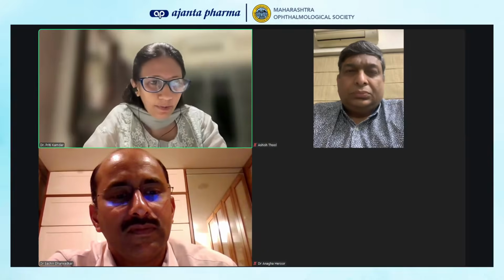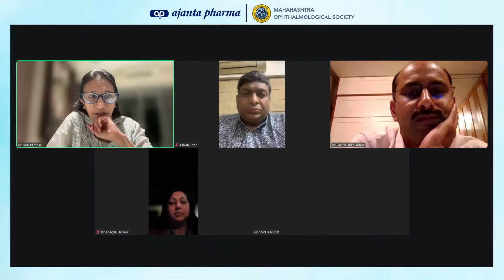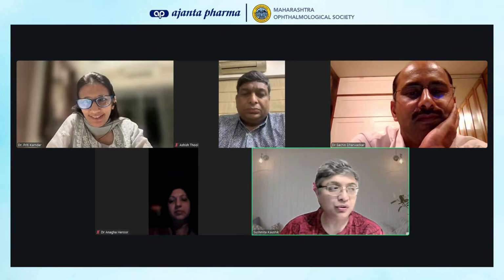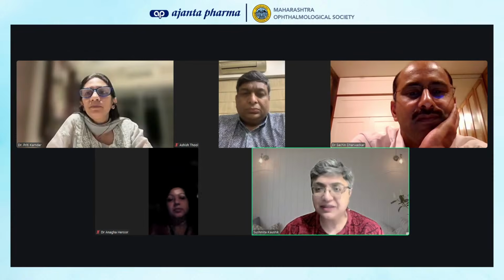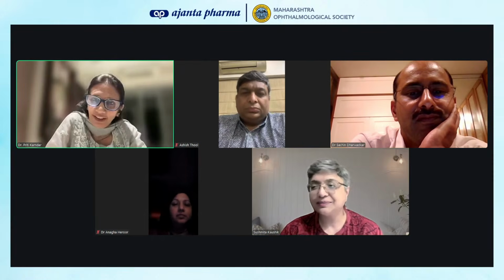Yes, so glad to be back. So Dr. Sushmita, one last tip for patients on OCT. One tip. Look at topography of disease before interpreting OCT findings. Look where the damage is.